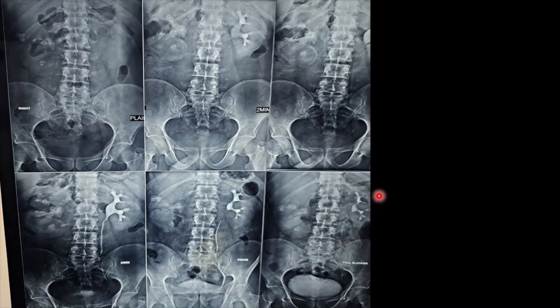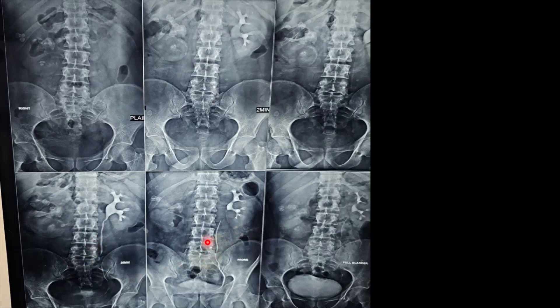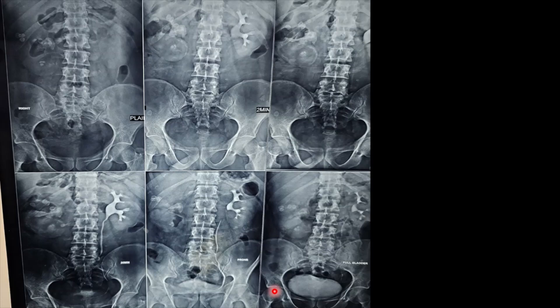So this is all regarding intravenous pyelography, also called intravenous urography or excretory urography. You have to assess the films in sequence: the plain film, two-minute film, five-minute film, then the 15–20 minute film. Prone and oblique films may also be given, along with the full bladder final image, based on which you make the diagnosis.